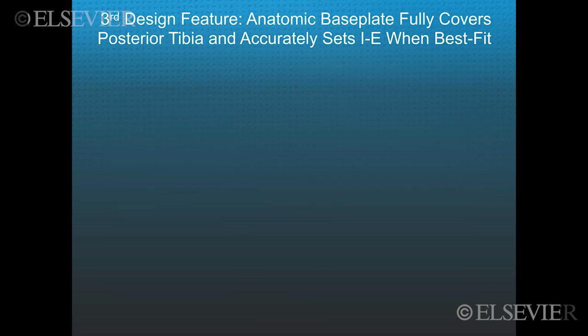The third design feature to reduce the risk of rim wear is to have an anatomically designed base plate that fully covers the posterior tibia, with an insert that fully covers the posterior base plate, and that when you best fit the anatomic base plate, it actually sets internal-external rotation of the tibial component and insert parallel to the flexion-extension plane of the knee.